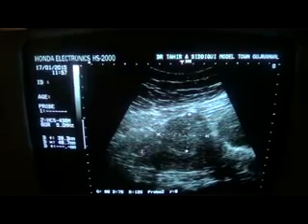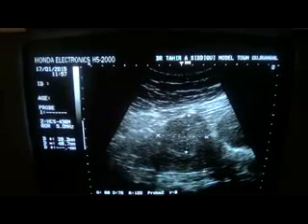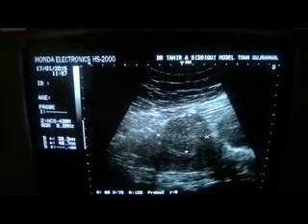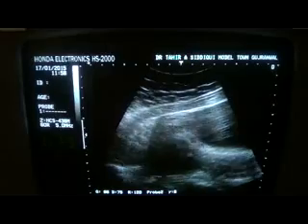This is the fundal region. This is the posterior myometrium in this longitudinal section. So up to this point of the study, we have seen that there is a fibroid approximately measuring 4.6 by 3.9 centimeters with a bulge, and it is a subserosal fibroid.